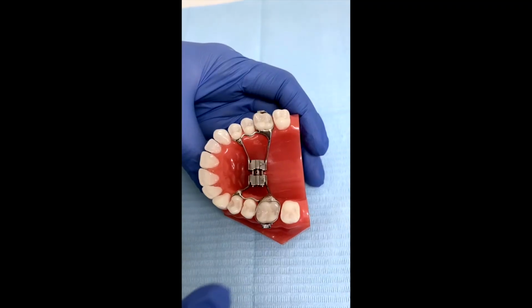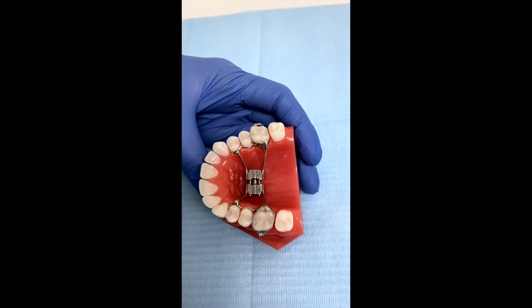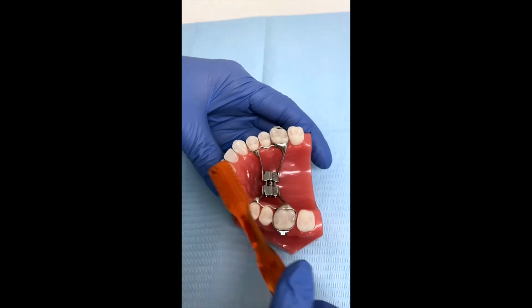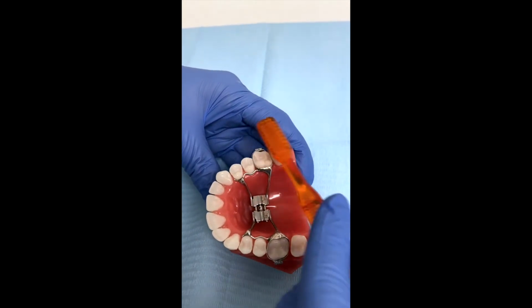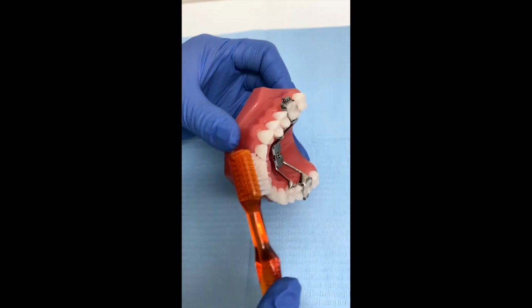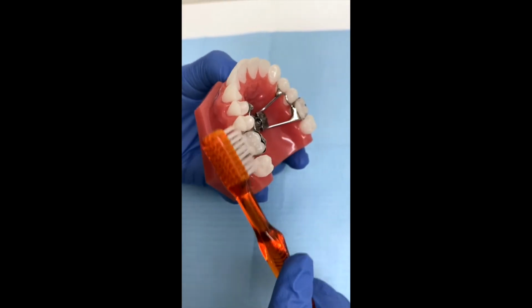It's also important that you maintain excellent oral hygiene, as food and plaque can get caught between the brace and palate or the teeth. Make sure you brush thoroughly 3 times a day, especially around the bands. If that's not always possible, at least rinse with mouthwash after eating and brush and floss your teeth as soon as you can. Please do not try to fit the toothbrush between the expander and the palate.